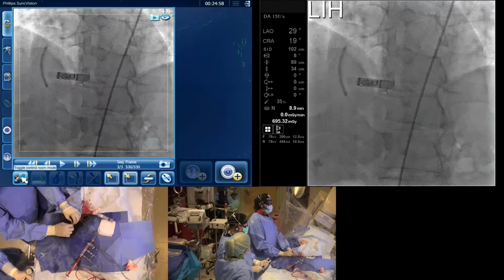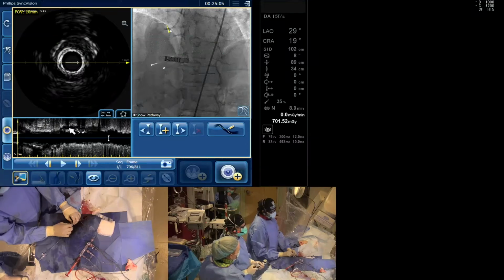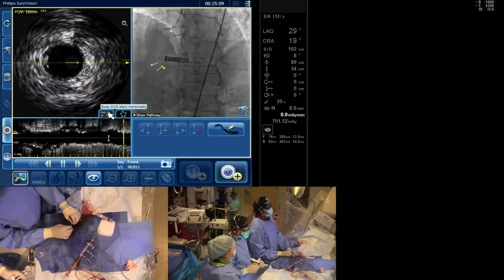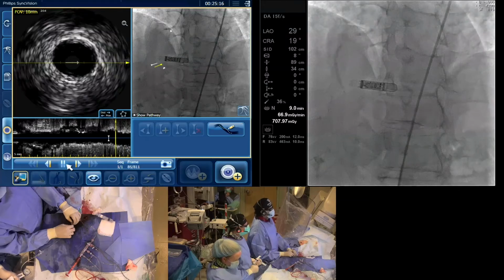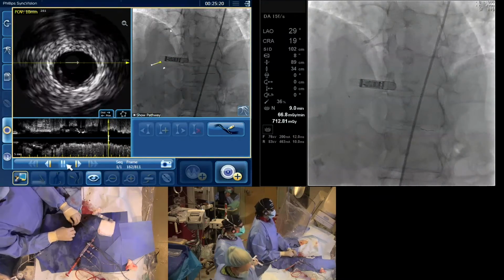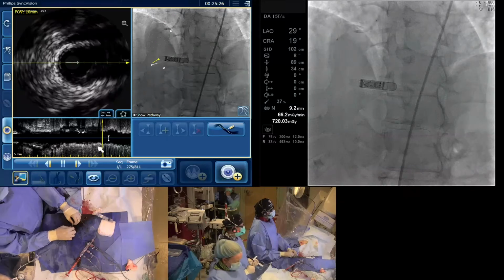All right. 14. Okay, so it's not too long of a stent that is left. Down. Although, remember, the guide is in pretty deep. Yeah, so I would say a 28 maybe. Let's just pull back. So this is a 38. So let's just see, right? If we look at that, this is probably half of that. So maybe even a 23.